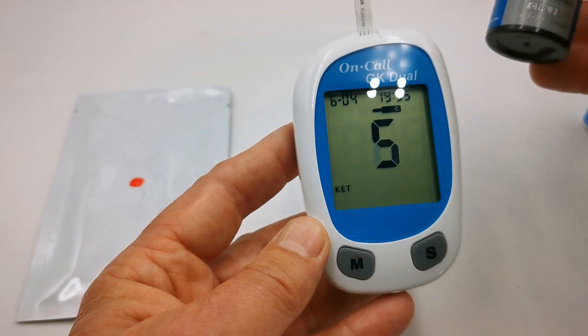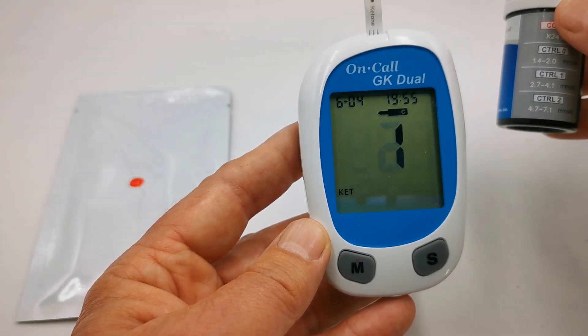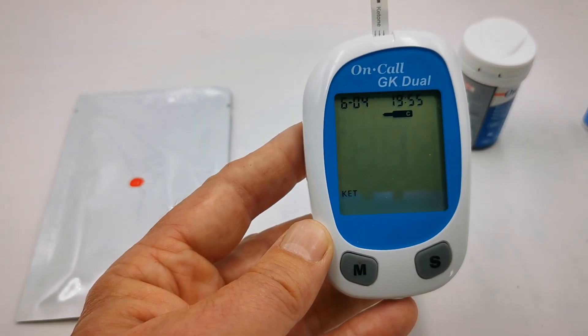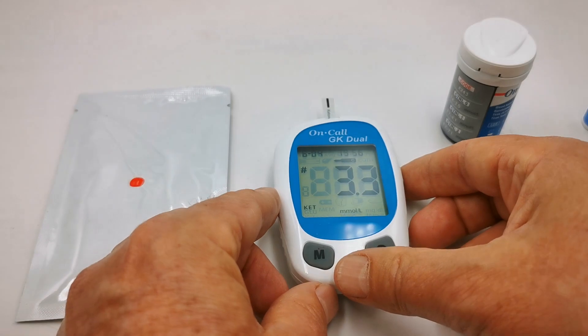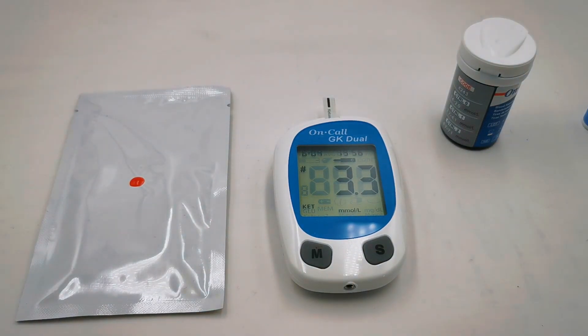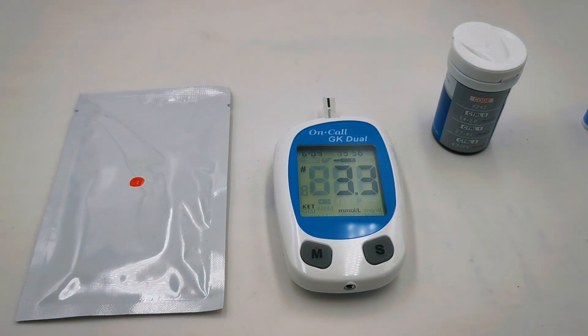Again, it's counting down. We're looking again for a control one reading of between 2.7 and 4.1 — and we're getting 3.3. So the function on this meter is absolutely fine. It's within its control range. If you want to repeat that for the other control solutions, the range displayed should be within that code check range shown on the test strips you're using to run the control.